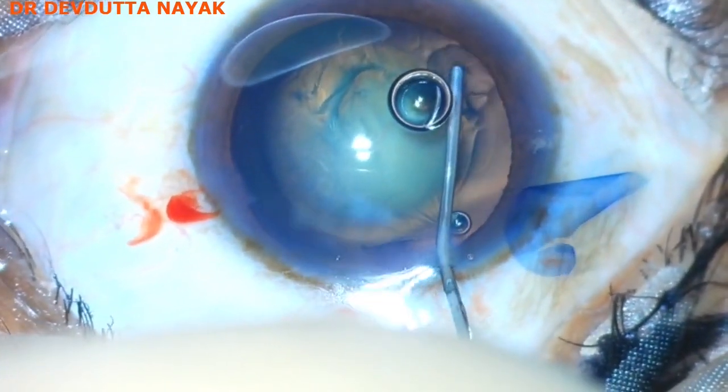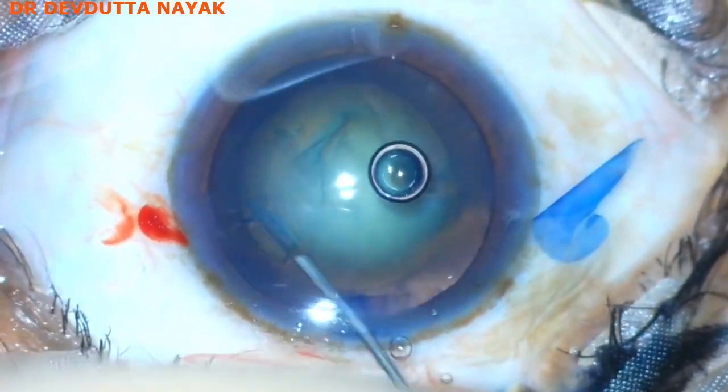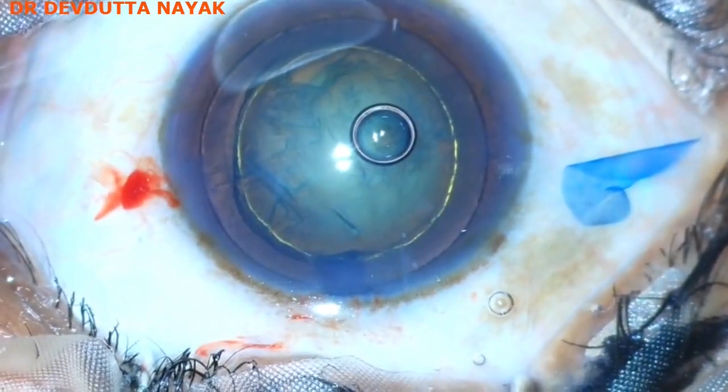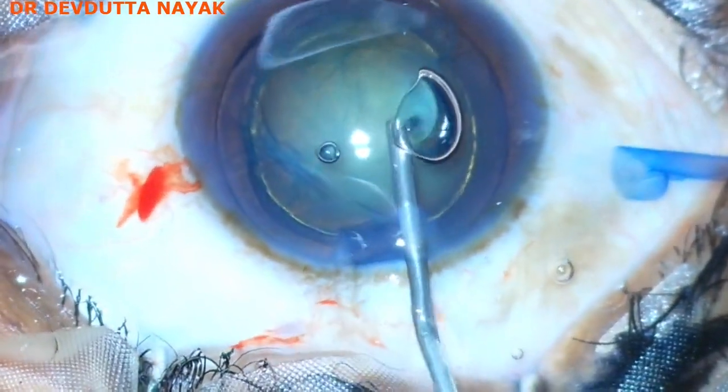Multi-quadrant hydrodissection is being done, then hydrodelineation is done. You can see a beautiful golden ring appearance. The chamber is again reformed with HPMC.